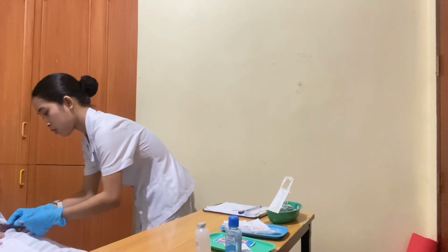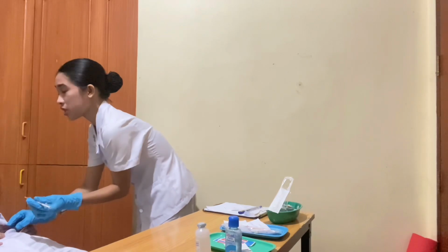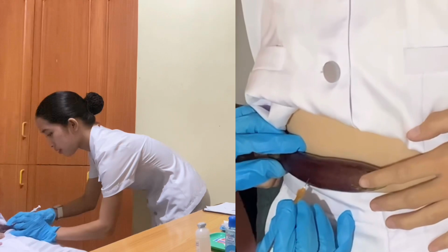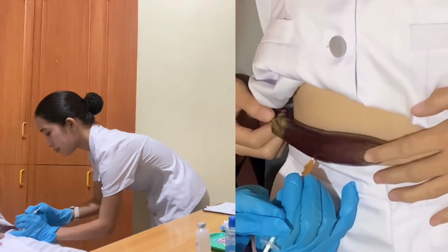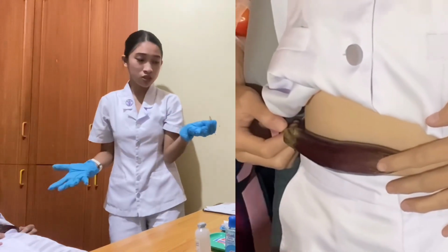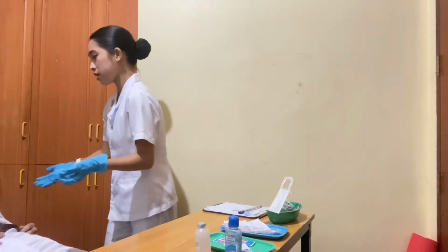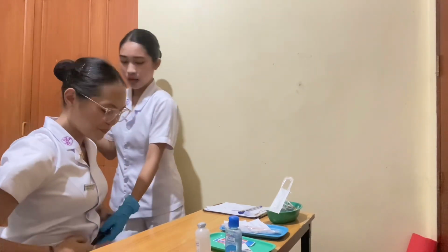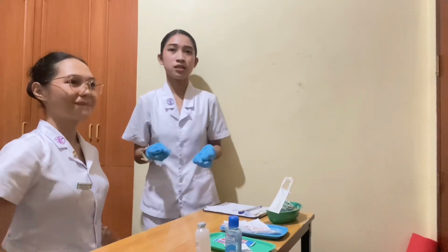By using a 45-degree angle. Okay, ma'am, mag-inject na ko, ma'am, ha? Then dispose this to the sharp container. Okay, ma'am, thank you so much, ma'am. You can now do the aftercare. So, proceeding to the next.